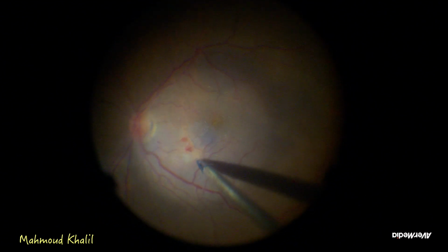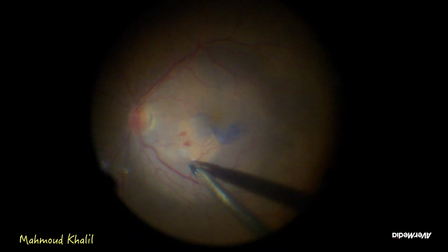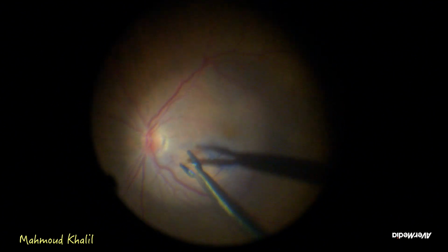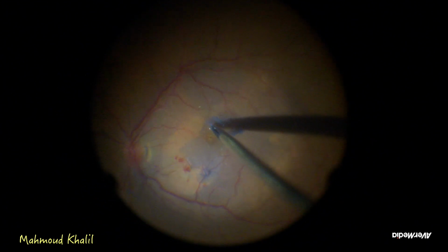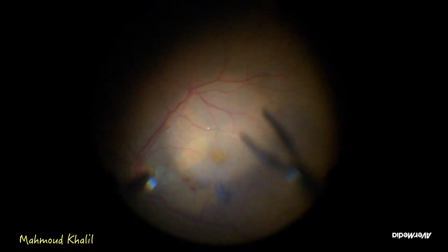The staining is to identify if the ILM is removed coincidentally with the epiretinal membrane or it needs to be removed, what is called double staining. After staining of the ILM, then removal of the ILM over the macula.